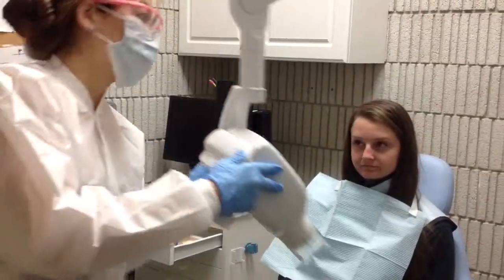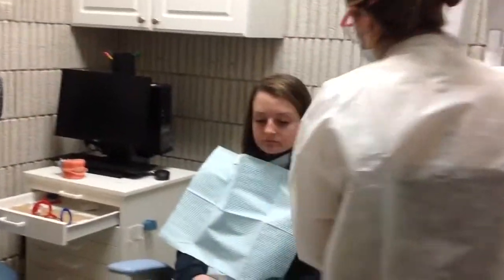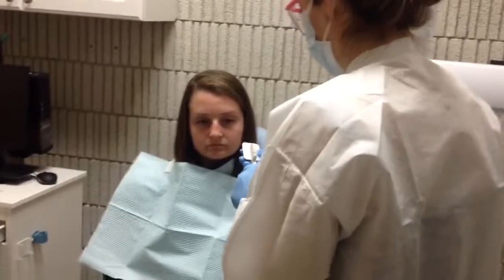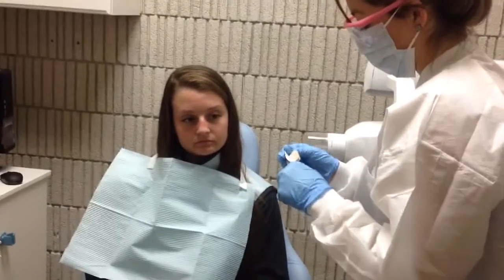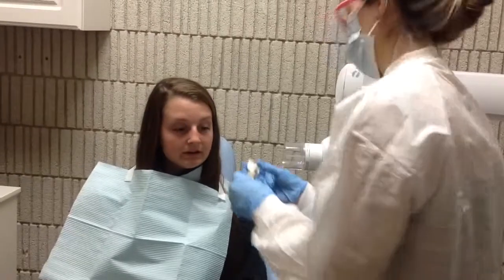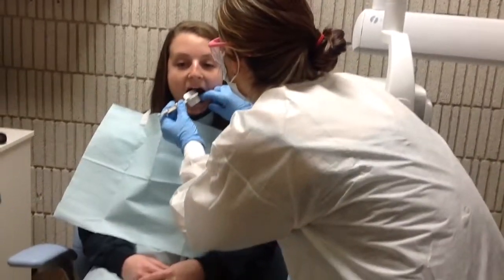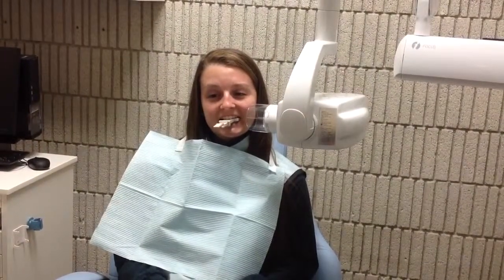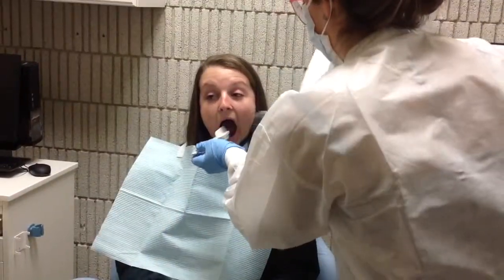We're going to try it on this side to see if this is a little easier for you. It's kind of the same thing as the red piece that we used, but it might actually be a little bit easier for you. And this time, I'm going to have you lift one of your legs when we're doing it, okay? Okay. I'm going to have you breathe in and out of your nose, and lift your leg, and bite down, bite down. Good job. Stay nice and still. Beep. Awesome, open. Awesome, Erin.